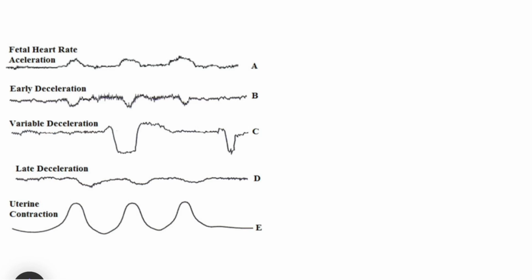Now, a doctor posted in Obs and Gynae, you should jolly well know how to read a CTG. The basics of CTG starts with identifying different accelerations and decelerations because they carry profound importance in choosing prompt intervention. Now, fetal heart rate variability can occur as in fetal heart rate acceleration.